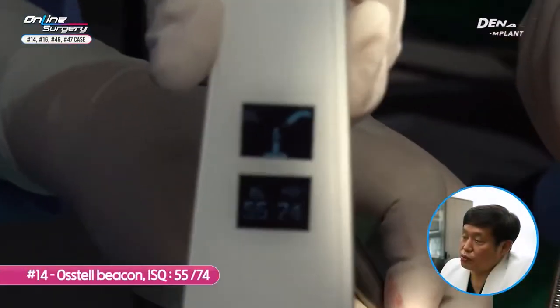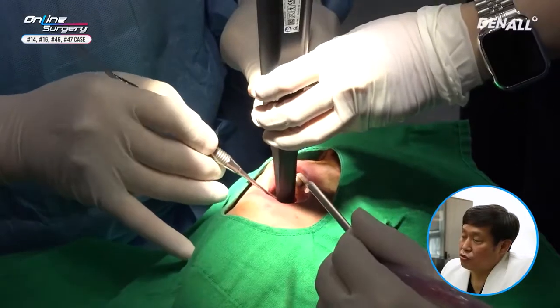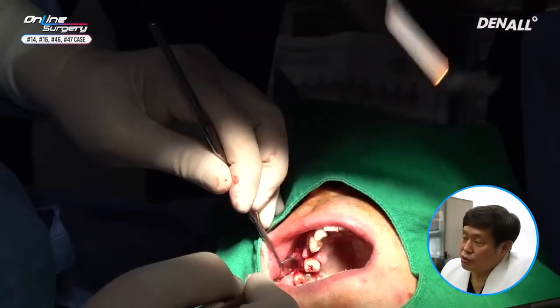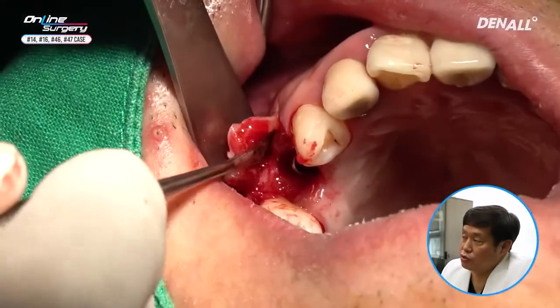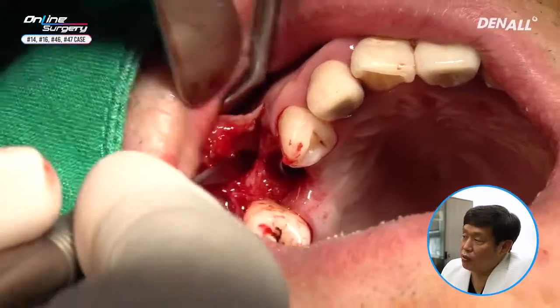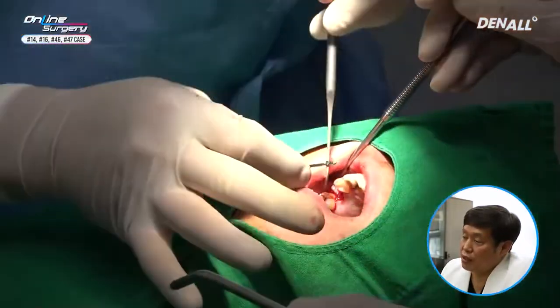ISQ value on one side it is 55 and 74. The distal one it is about 66 and 66. GBR will be performed after reflecting flap. I'm going to check the fenestration defect on the buccal side.